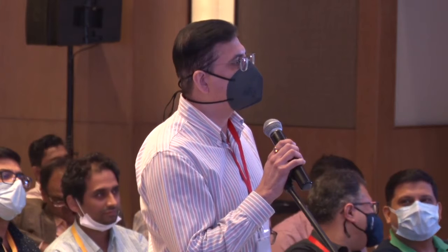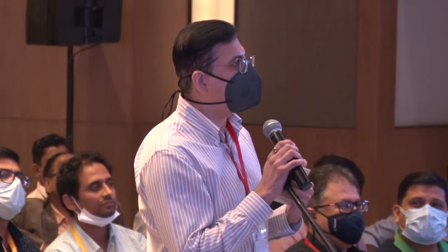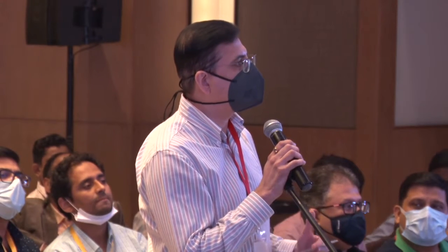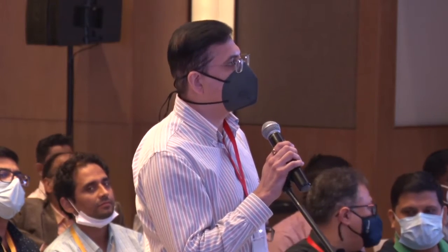One final question. Yeah, please. I'm in fact happy you're asking a question, because at 7:30 in the evening after a heavy day, if you still have that interest, I think we should be really here to answer those. When you're doing an OCT in an ACS setting, because of diffuse sympathetic overactivity, many a time the vessel is undersized. And no matter how much you may flood the bed with nitroglycerin and nicorandil, still you may not get the correct size on OCT when you need to stent the vessel. So how do you go about sizing the vessel on the basis of OCT in the setting of ACS?